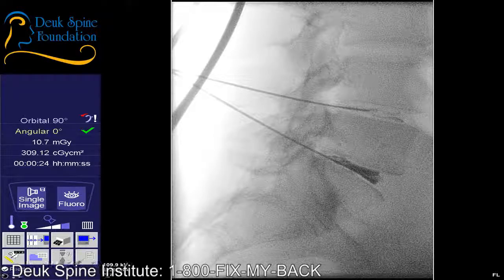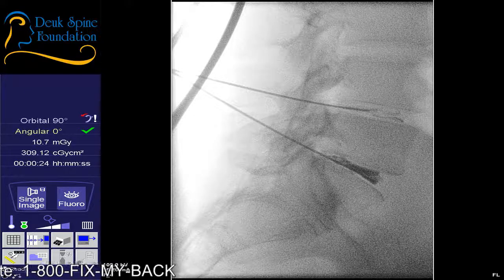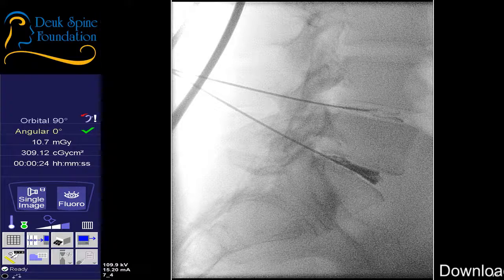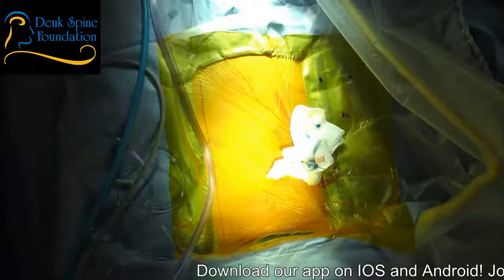All right. We're going to get started. Can you count out loud for me? All right. So I've got the guide wire in. I'm going to bring the needle out. Okay. And we're going to use this guide wire to guide our instruments to do the surgery. Specifically, the guide wire will guide this guy first. This is called the dilator. That's my shot right there.